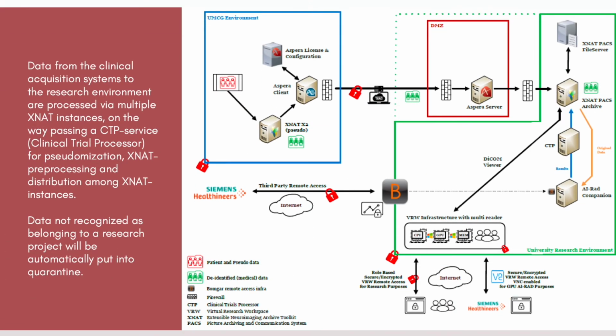Within the protected VRE, various data management and artificial intelligence image processing services are made available to the end users to perform image data analysis. One example is shown here. The AI tools acquire their data from the XNAT storage and also return the AI results into this environment.